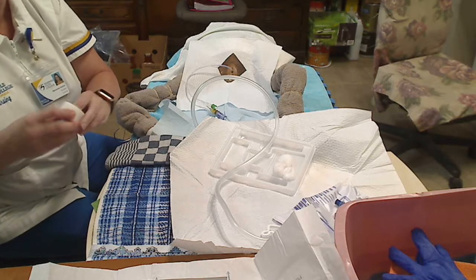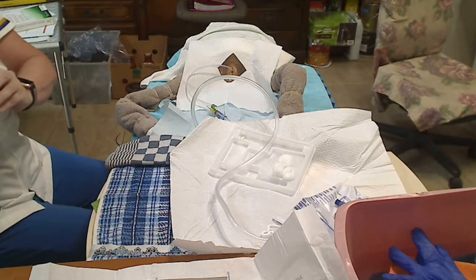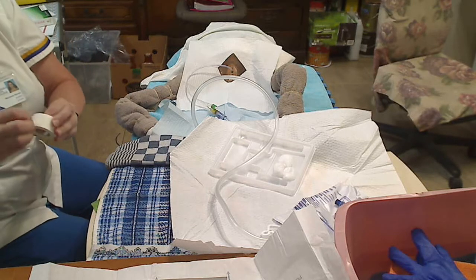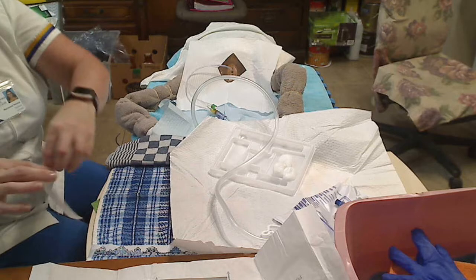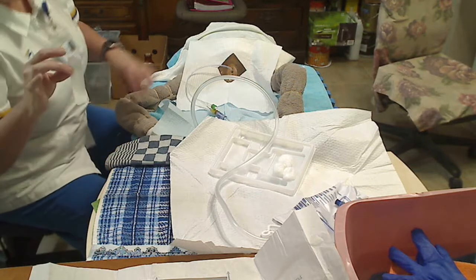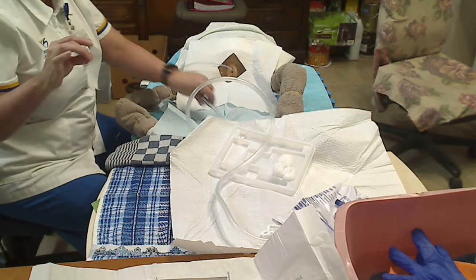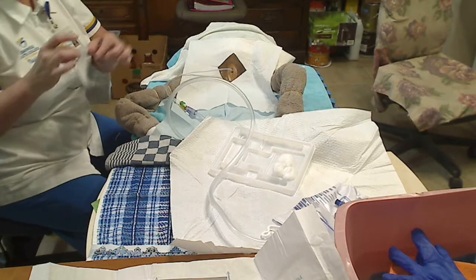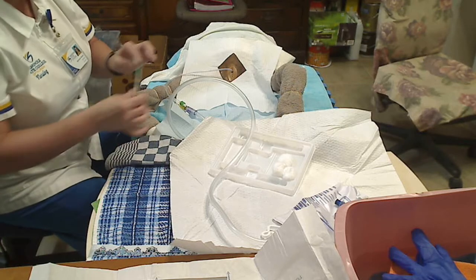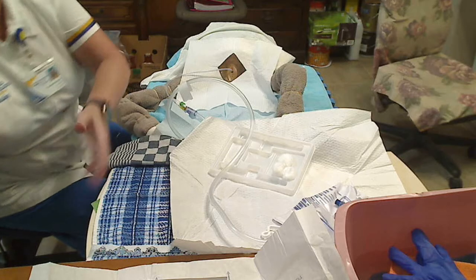This one doesn't want to have a piece on it. Which is why you should always carry 2 rolls of tape in your pocket. Typically, I would throw this away, but I have to leave it in place for now because of needing to use it over and over again. So I am going to place my tape onto the tube just to hold it in place.